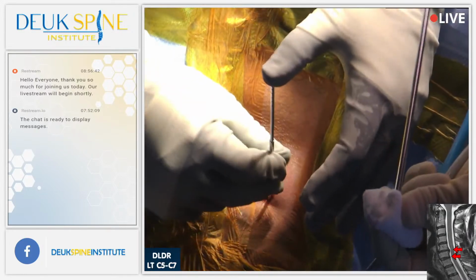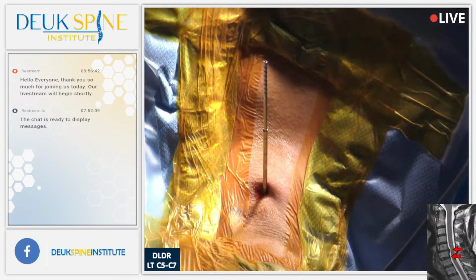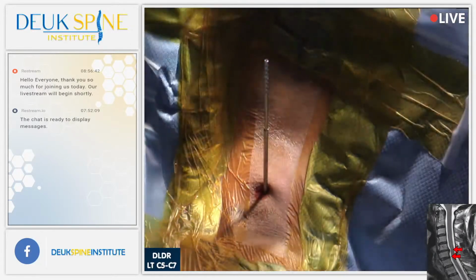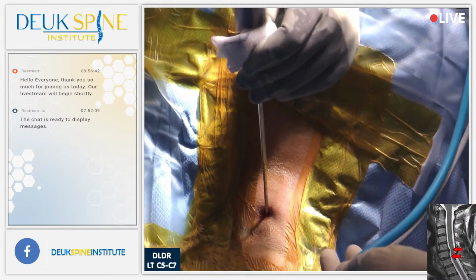We're not the first to do endoscopic surgery, but we're the first to do an annular debridement and clean the tear from which the herniation comes so that it can heal and so no more herniations come, as well as no more neck pain. By cleaning the annular tear, we get rid of the neck pain.